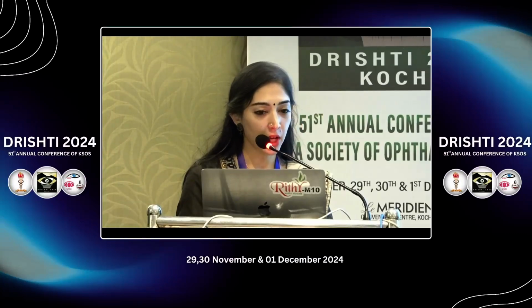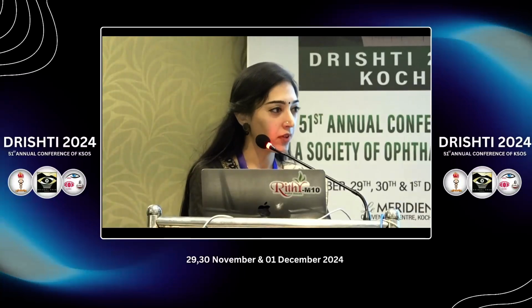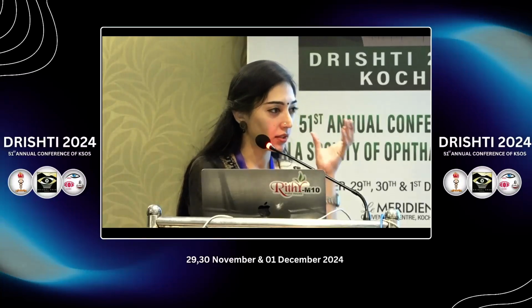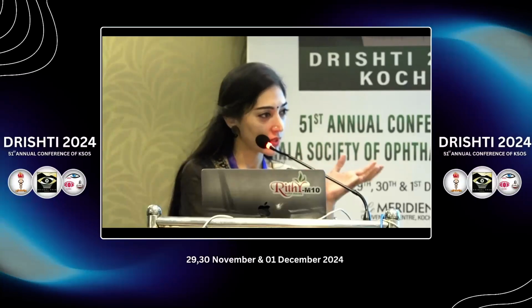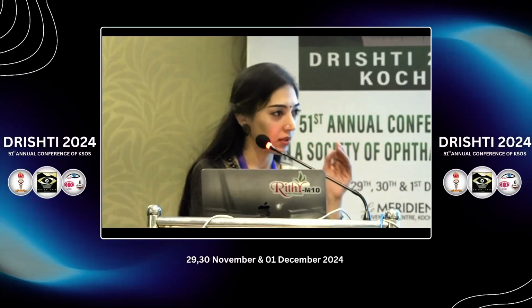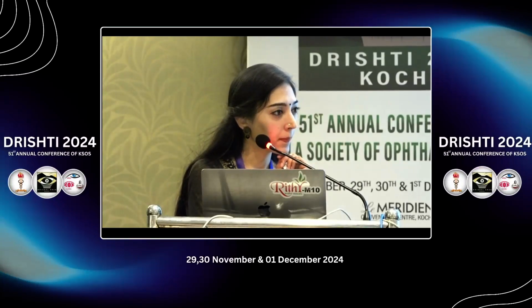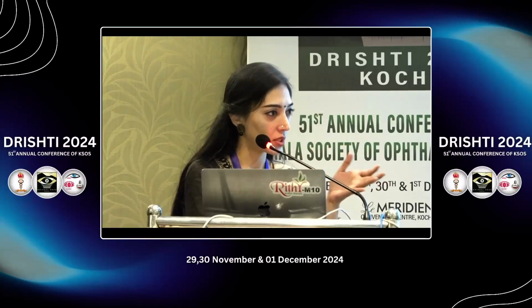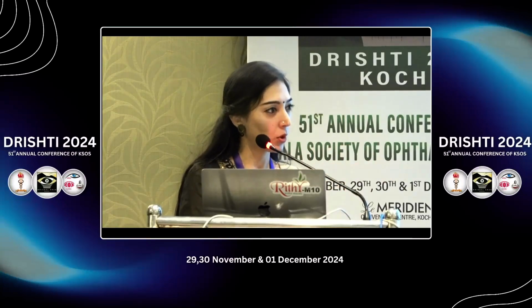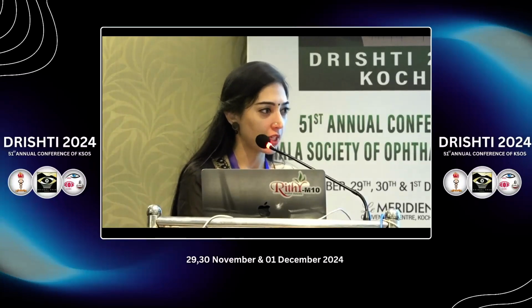So the negative biomarkers I had mentioned were the foveal involvement of SHRM, then the hyperreflectivity of SHRM, well-defined SHRM borders, and the increased area, width and height of SHRM. It would prognosticate that. What are your recommendations for these negative biomarkers? How should we treat them? We have to intervene more, in the sense, probably switch the anti-VEGF regimen, or we have to increase the frequency of anti-VEGF therapy.